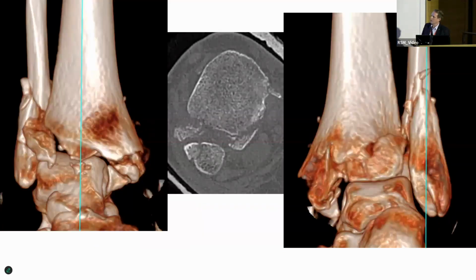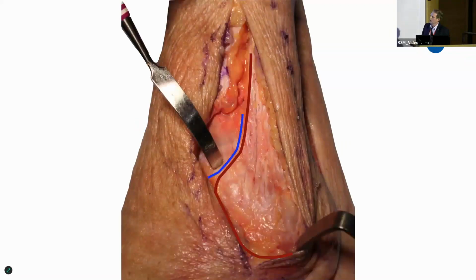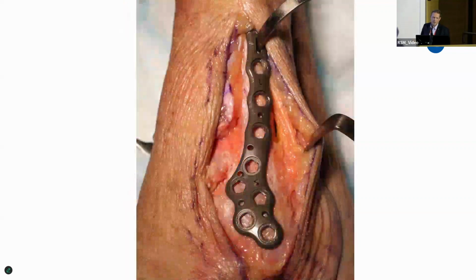Anterior fibula or syndesmosis, you can't get to this. So if you've got all this mess at the front here, doing direct lateral, even a little bit further anterior, I'll show you, I bring my incision a little bit more anterior on my fibula, you can get to the anterior Chaput. You can even do Chaput fixation through that. So this is where I make my incision here rather than the direct lateral. And by doing so, you can see into your syndesmosis, you can get across the front of the anterior tibia. And you can even fix the fibula from the front if you're doing an anterior pilon. You can see.